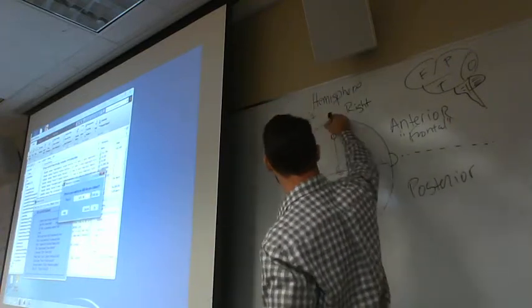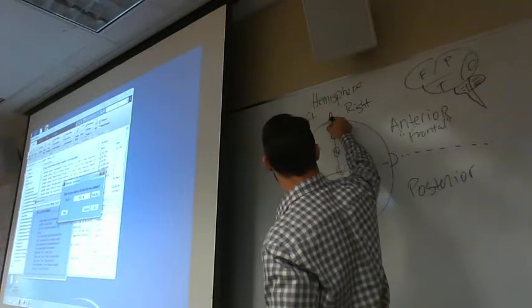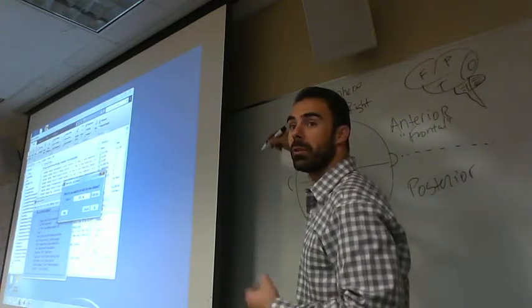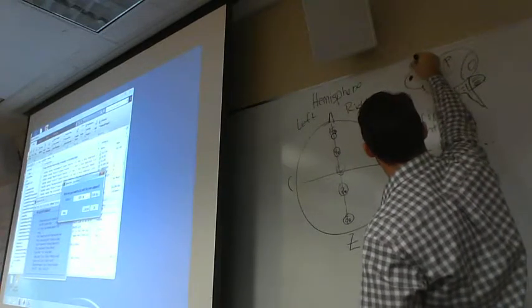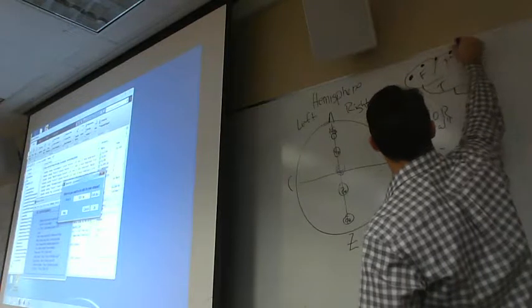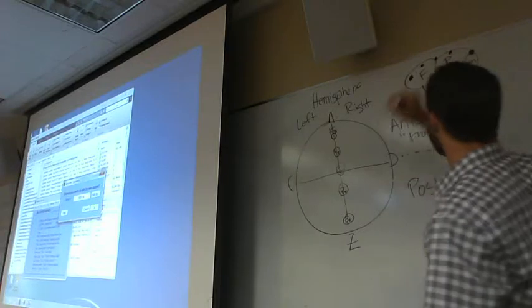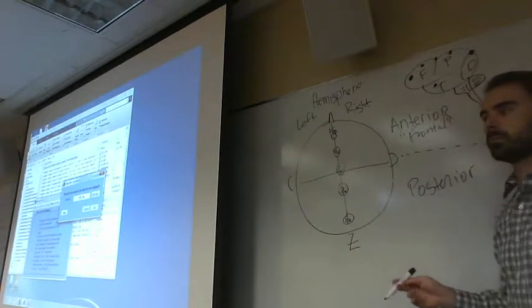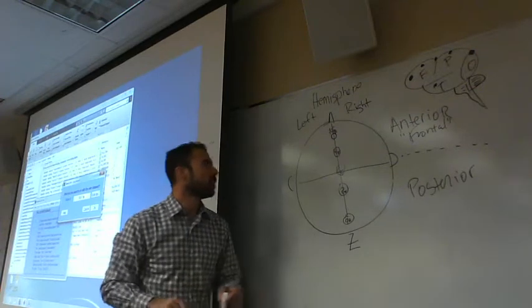Okay, actually we're going to call this one AF, for anterior frontal. So you could have basically a set here: anterior frontal, with frontal there, central, parietal, occipital. And of course, you're going to have temporal one there. Make sense? Terrific. So let's look at it some more.